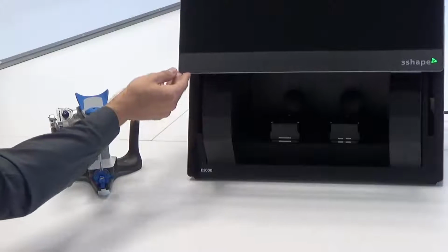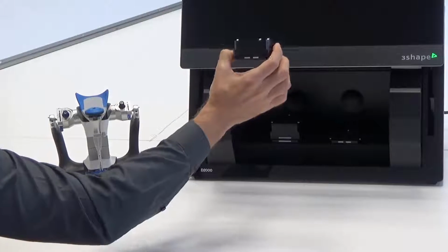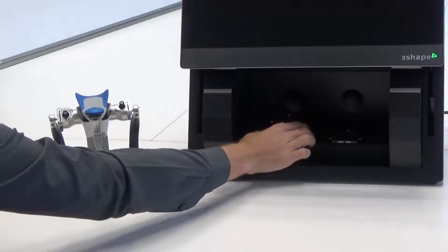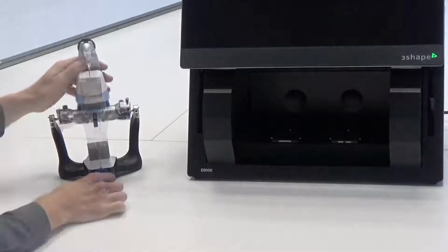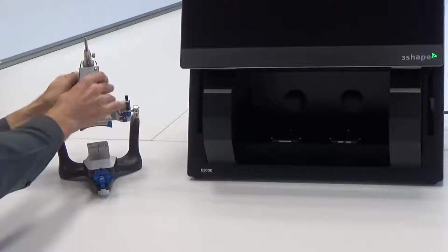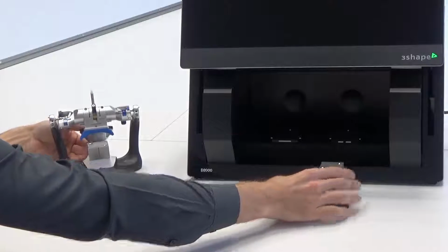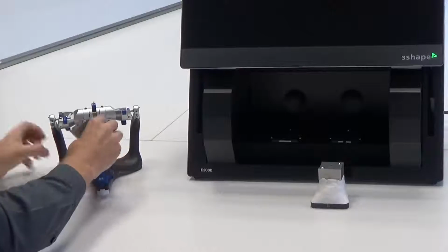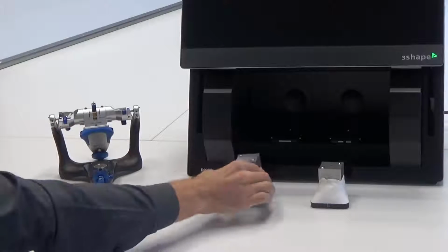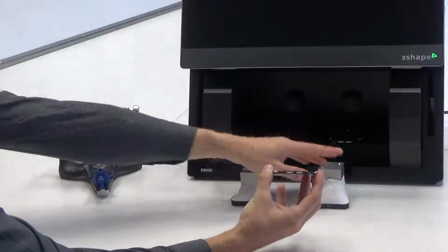Now open your scanner and remove its height adapters, or adapter if you do not use the D2000. Then remove both mounted parts of the Occlusal transfer calibration object from the articulator and set it on transfer plates for that articulator.